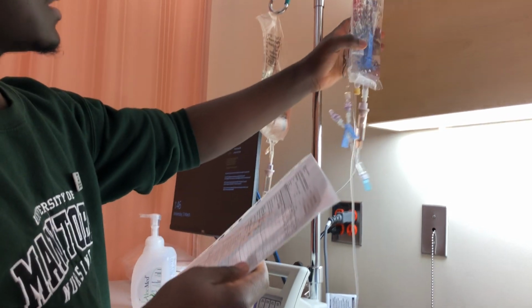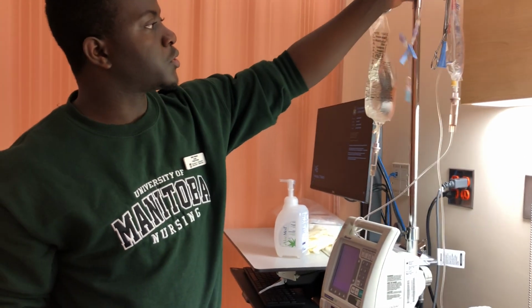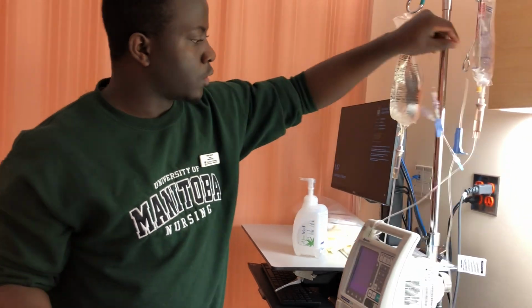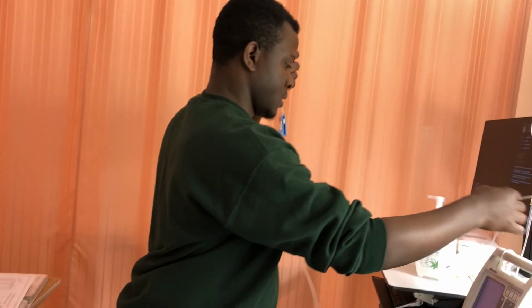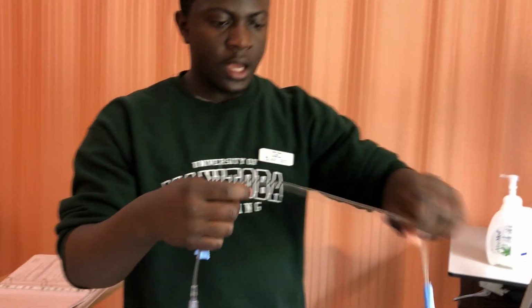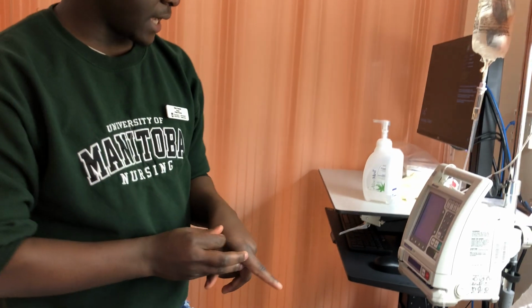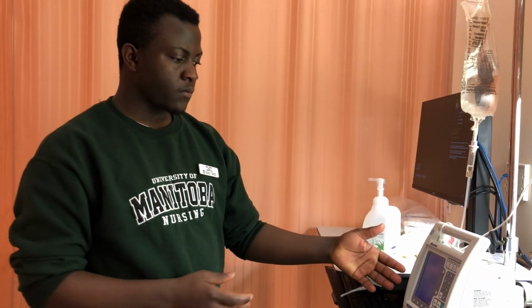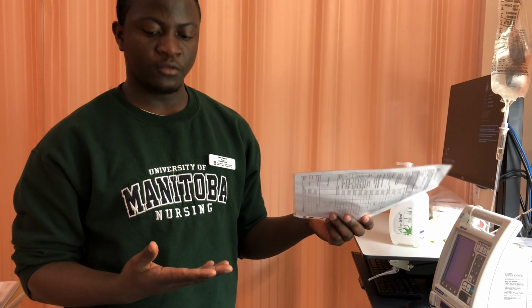I've basically done all my checks, and at this point I will check the tube to make sure that it's going to be going in at the right tube. At this point I can get my second nurse to double check all of this with me, because it's a high alert medication. So at this point I'll get the second nurse, and the second nurse will basically go over all those checks again.